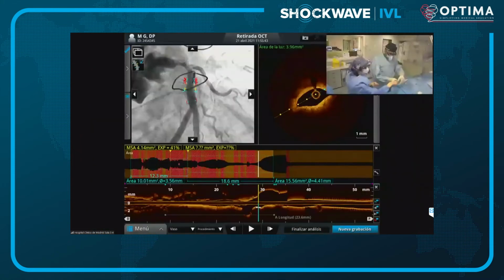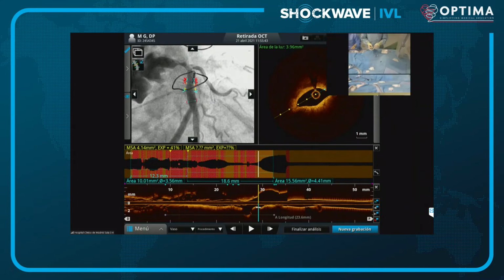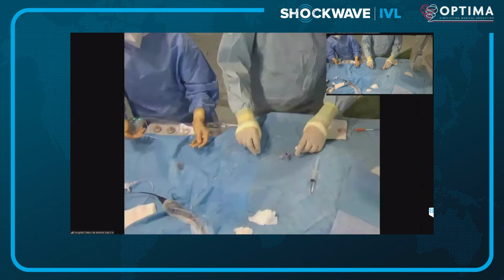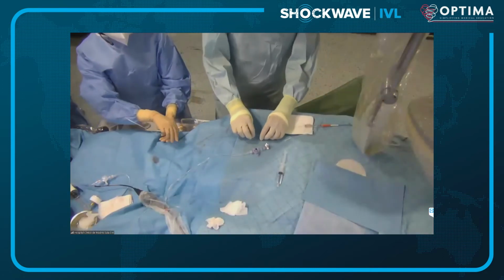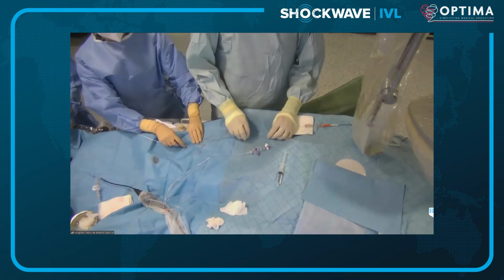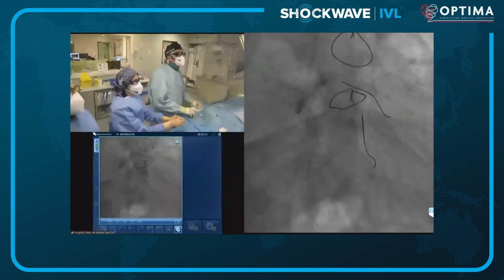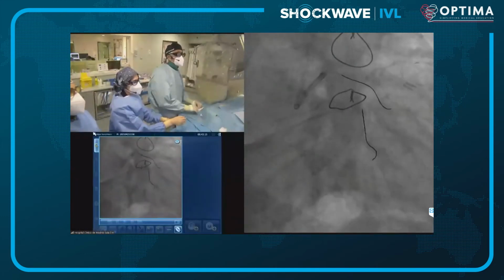to the wire. In the meantime, we also placed a wire in a small vessel that, you can see, can you show the whole screen, Adam, please, with angiography, et cetera? Okay, so now you are seeing, oops, the wire is moving a bit. Working back a little bit. Sorry, my wire has moved a bit.